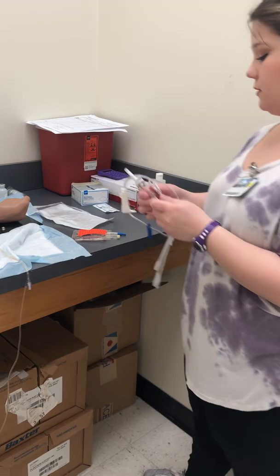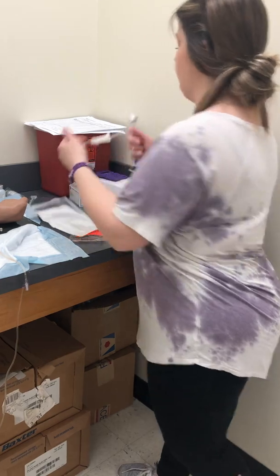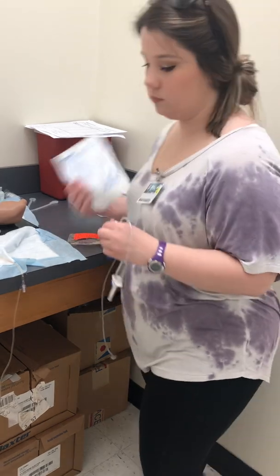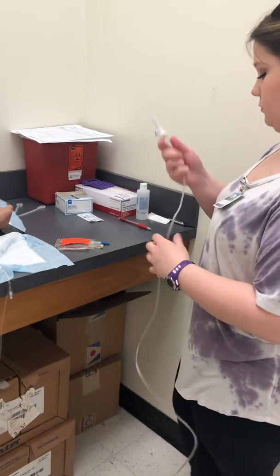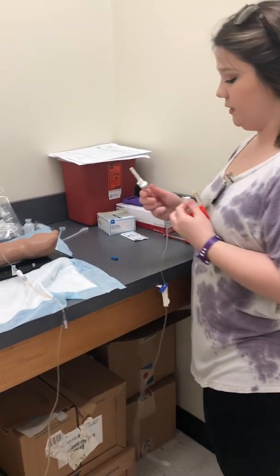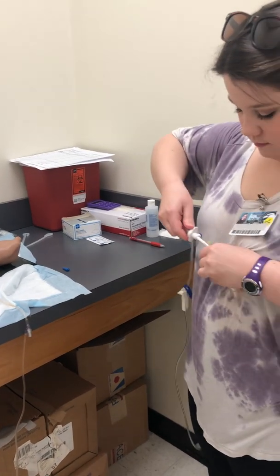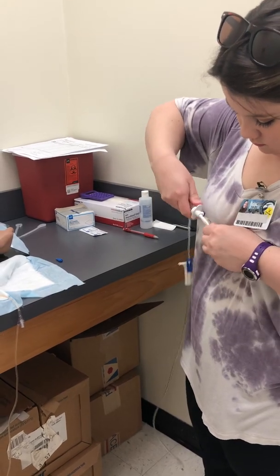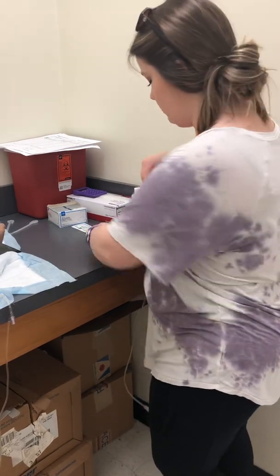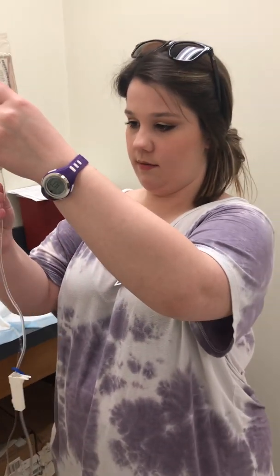I've already washed my hands. Okay, I'm going to clamp this off. And go ahead and swab my bag. Now that my bag is clean, enter the spike in the chamber.